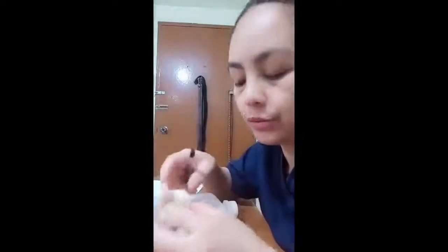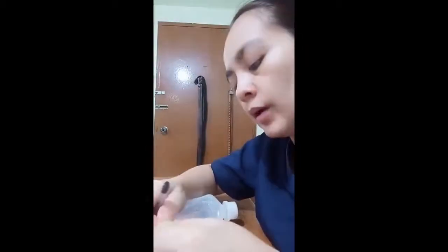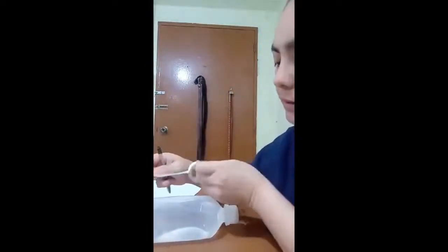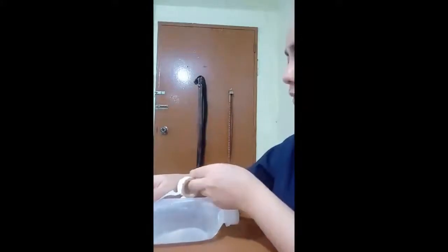Next, we're going to determine the time, how long it takes for the IV fluid to run for the hours that were computed. So we will just put a tape and secure it on the IV fluid bag. And then we will have to mark it accordingly.